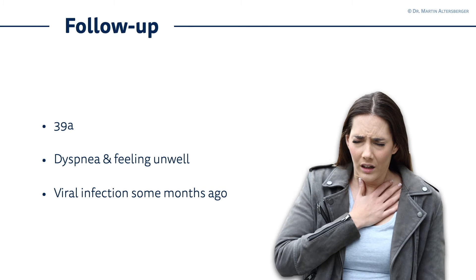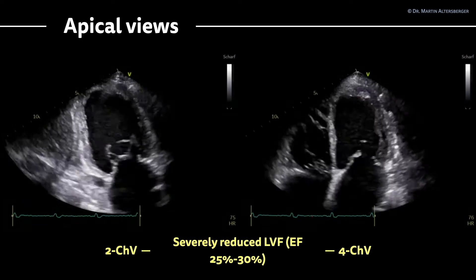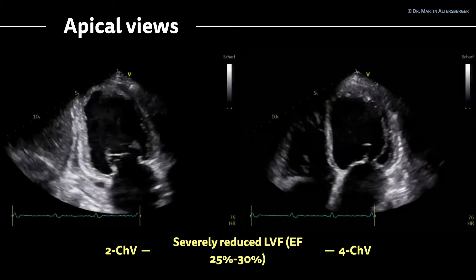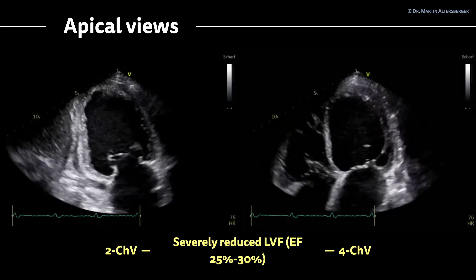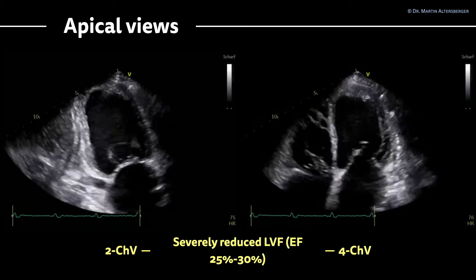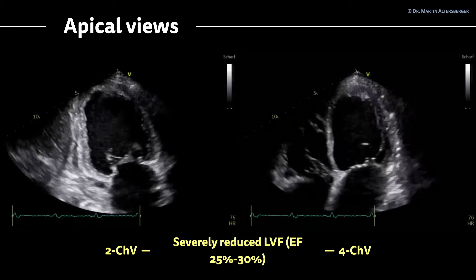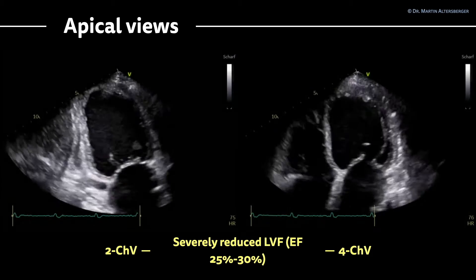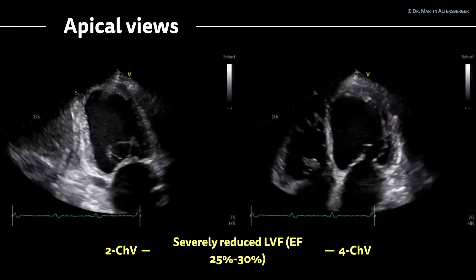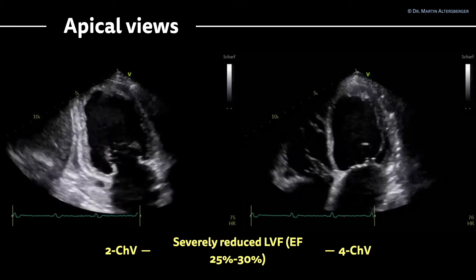Recently, we discussed a young 39-year-old female patient with dyspnea who was feeling unwell. She had a viral infection some months ago. If you take a look at the apical views — the apical 2-chamber view on the left side of the screen and the apical 4-chamber view on the right side — we do see a severely reduced left ventricular function.